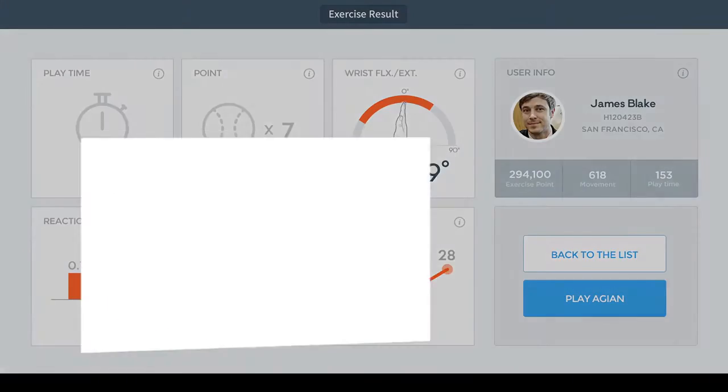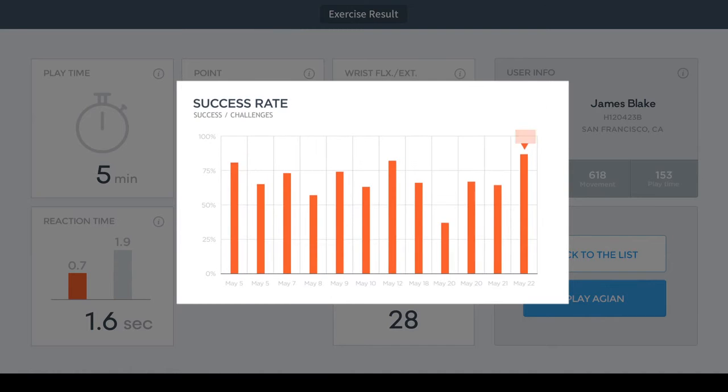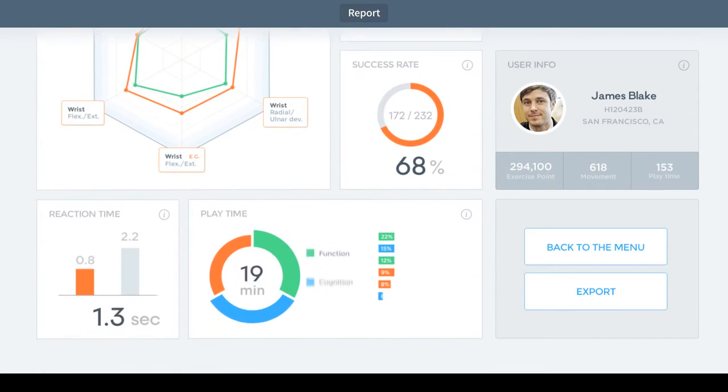In particular, a patient can check the performance with a therapist after each practice set is done, which gives a patient courage and a feeling of 'I can do it.' At the same time, it allows the therapist to grasp a better and more precise understanding of the patient's condition.